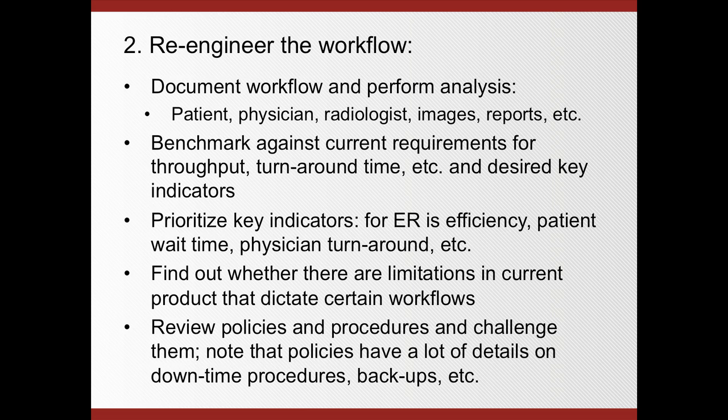However, other PACS systems might actually be more flexible and also facilitate other workflows. These all have to do with, for example, making images available in the worklist, holding images back, doing QA steps, things like that. So the second time around, it's even a better opportunity to re-engineer the workflow. And of course, you do that by documenting it and analyzing it.